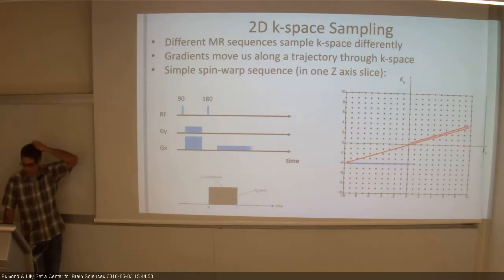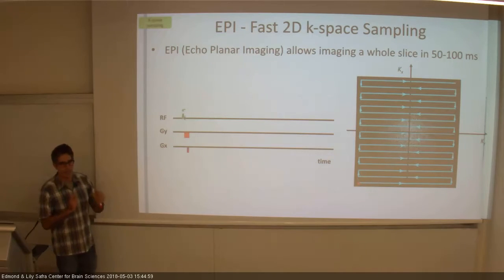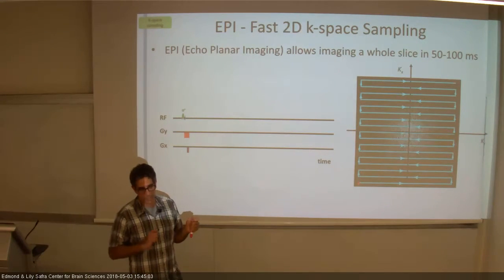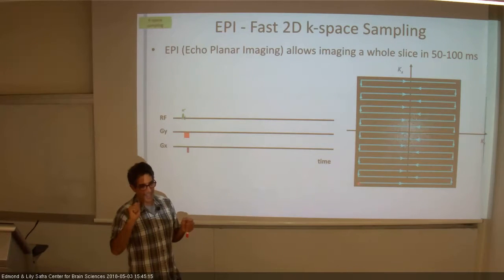I did that already. Here it is. What we're going to do is turn on and off, on and off, on and off the gradient very fast. That's what makes the noise in the end. Da da da da da da. It's the gradient turning on and off, these electrical currents. If you've been in a scanner, you heard the noise. We're putting a current, creating a gradient, closing it off. It's actually banging. The metal holding it is banging, and that creates the noise.